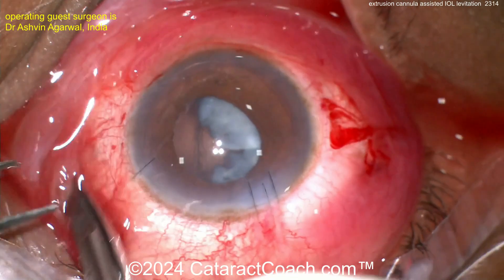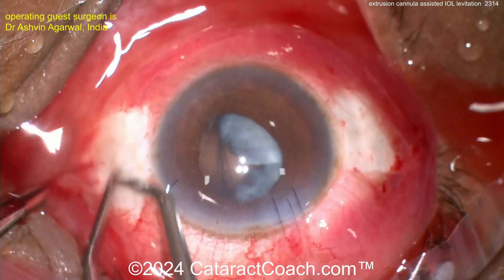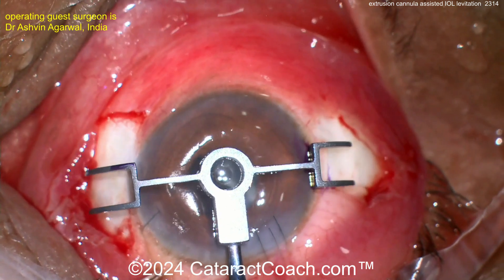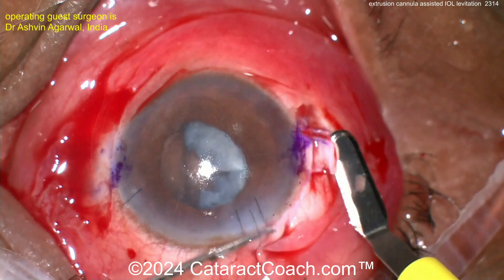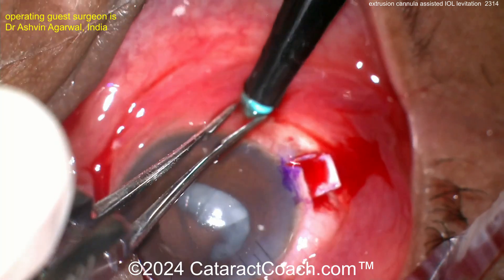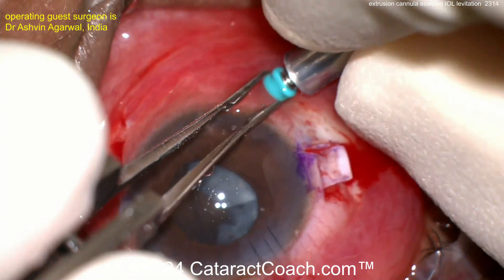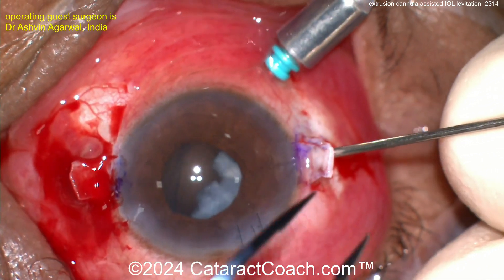There's still a lot of lens material, and some sutures in the limbus at the incisions. Dr. Agarwal Ashman is going to do a beautiful pars plana vitrectomy, also making some flaps for a glued IOL — so probably no capsular support. Here's the trocar going in and infusion going inside.